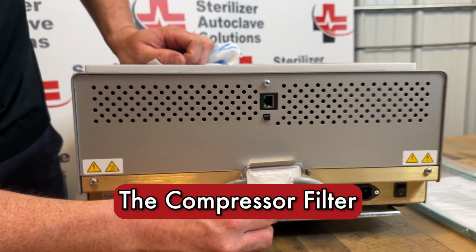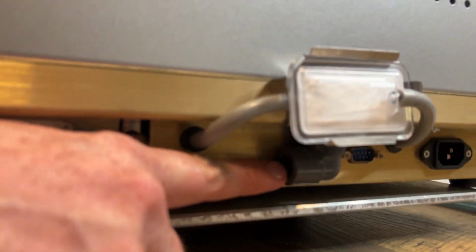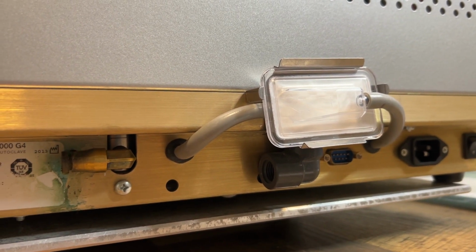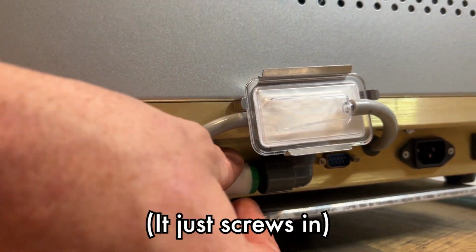Your compressor filter, this one is actually missing, is located right underneath of your biofilter. G4s will have a compressor filter, but not all 5000s do. This just simply screws into place.